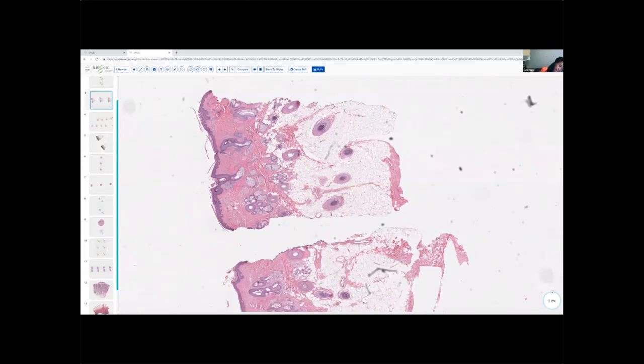We also have some of that catagen telogen shift. So we have some hairs where we just don't have those nice open anagen follicles at all, right? But other than that, we don't see those pigment casts, okay? We see sebaceous glands that are nice and preserved, so they are still there. And again, this is a differential diagnosis point.